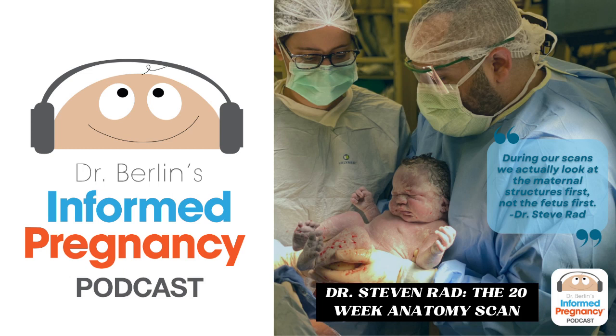That's a great question. Around 20 weeks, particularly the fetal brain and heart are developed well enough that we want to see specific landmarks that we look for in a screening fetal anatomy scan. The brain and heart are developed optimally to be seen at that time. So the brain is ever evolving and developing during the pregnancy, and certain structures don't show up sometimes until then. And the heart and the cardiac views are better with a bigger heart. So it's picked as that traditional gestational age range, mainly for those two reasons, for visibility and development of the fetus.